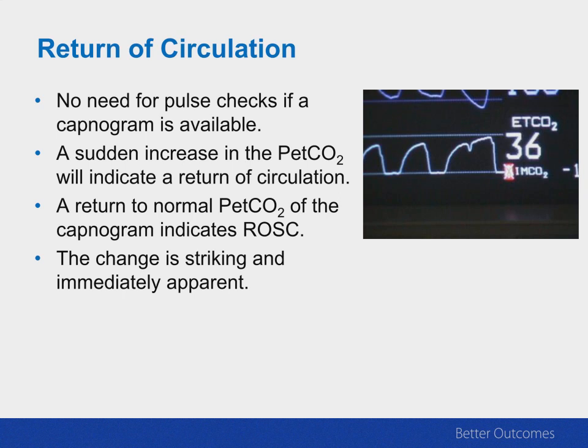The other thing you can do, and many of you may already be doing this, is that it's striking that if you just have a capnogram on during resuscitation, there's really never an indication to stop CPR, to stop chest compressions.